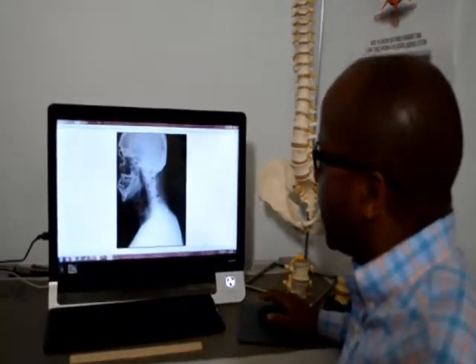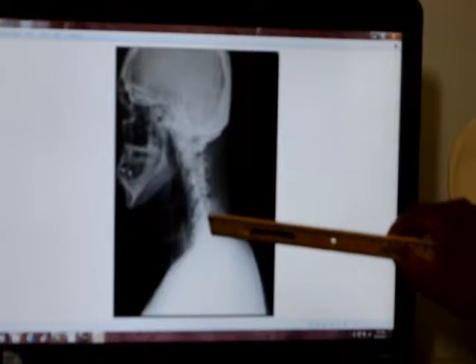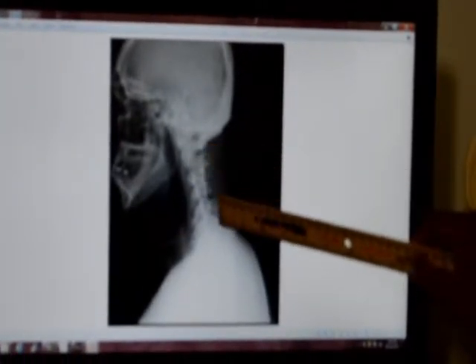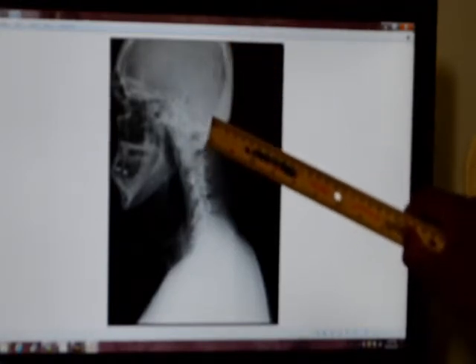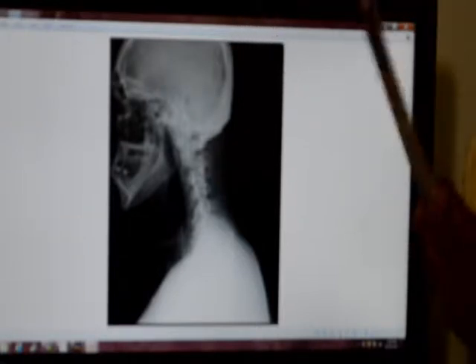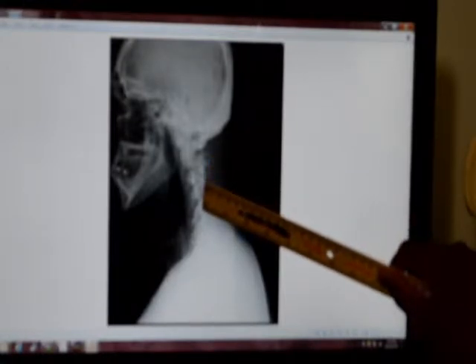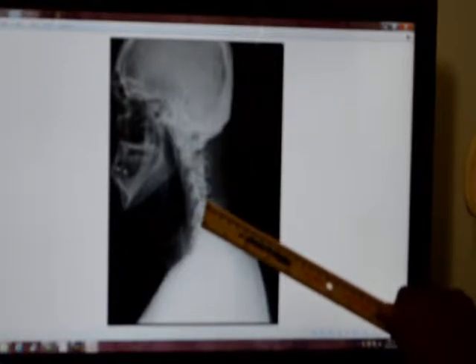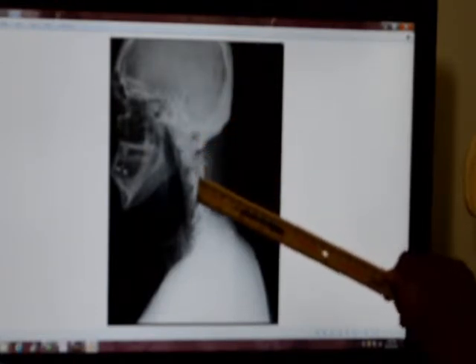Here on our screen we have a curve that is looking abnormal. What I mean by abnormal is you can see the curve of the neck — instead of going backwards like we've seen in the last series, this curve is actually going forward. When the curve goes forward, the joints lock. And when the joints lock, arthritis starts to form. Look at where this curve tends to bend — it's right at that vertebra. And when you look at that vertebra, you can see the arthritis is fully formed. These are what you call bone spurs. The main reason is because the curve is totally reversed.